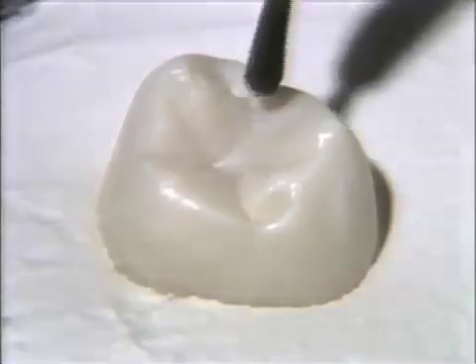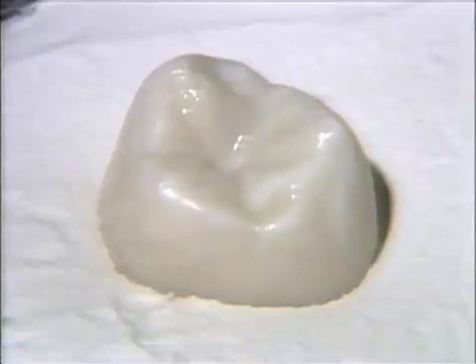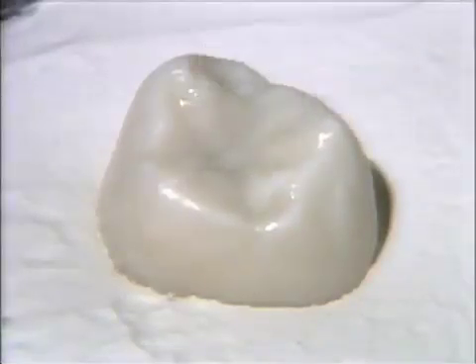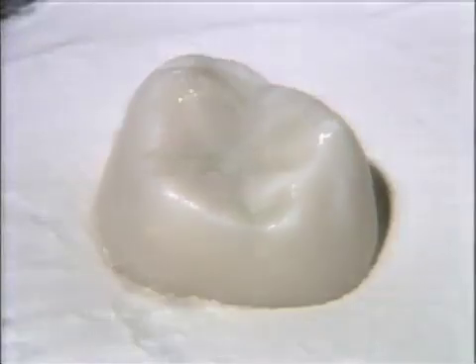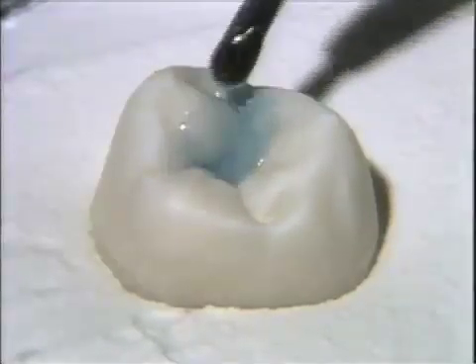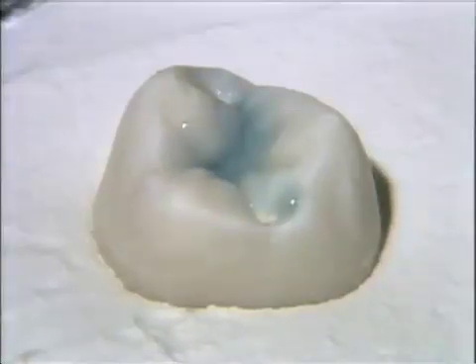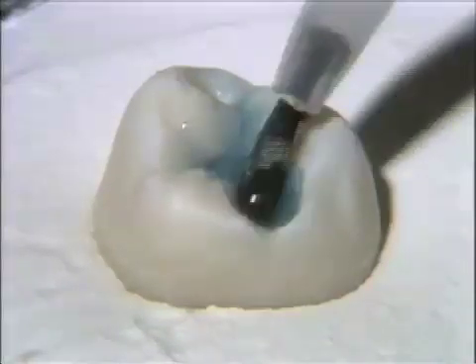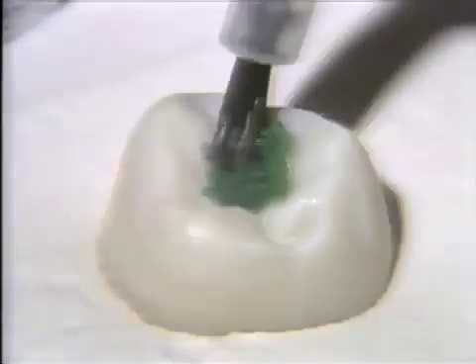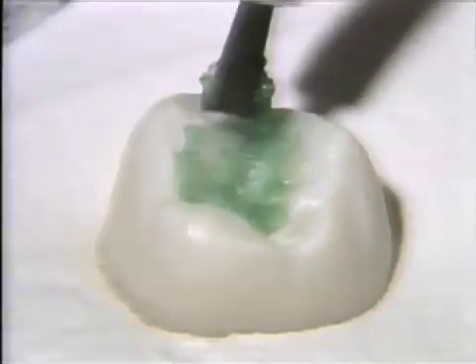Here, a liquid etch is demonstrated. A liquid etch adapts well to occlusal morphology, but it may be difficult to limit the extent of tooth coverage. This etch is a semi-fluid gel; the consistency of this etch allows greater control over its placement. This gel etch, which is more viscous, may be more difficult to adapt to irregular occlusal contours.